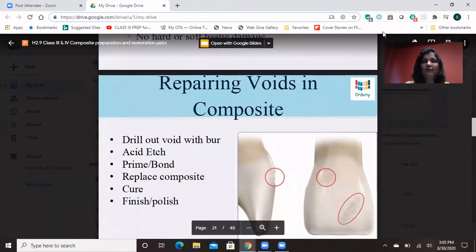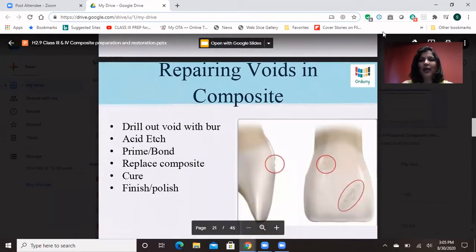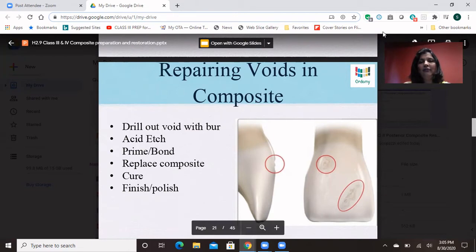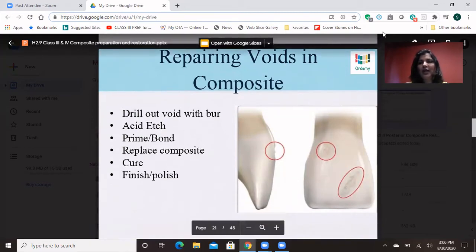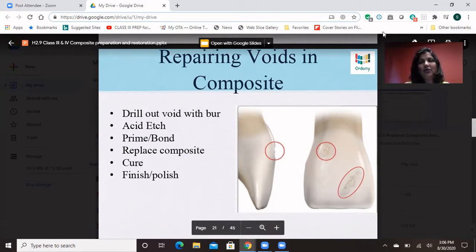How do you fix a void which happens in a composite? This is the beauty about composite — if there is a void, all you have to do is drill the void out, etch it, then prime and bond, put the composite, cure, finish and polish, and it looks pretty good. I do it a few times — it does happen and you just patch it up and it looks pretty good. The patient cannot even make out.